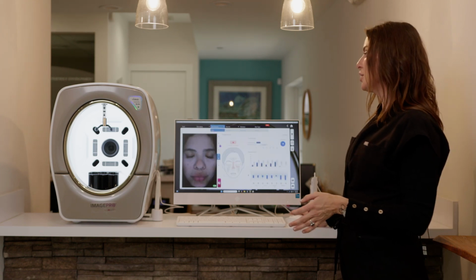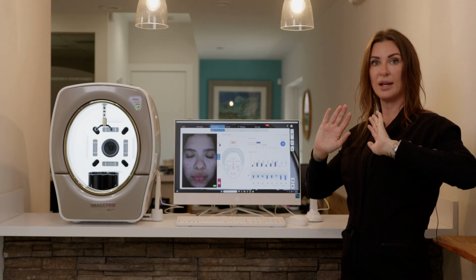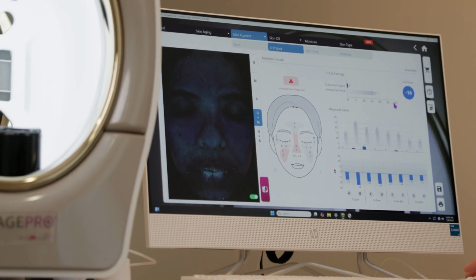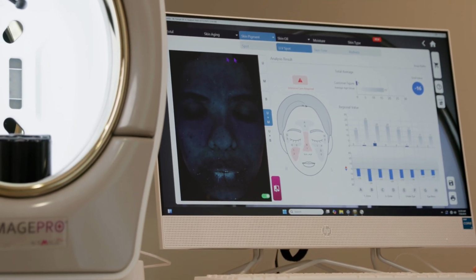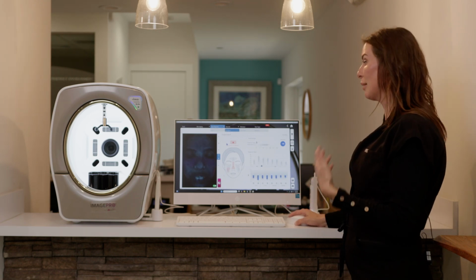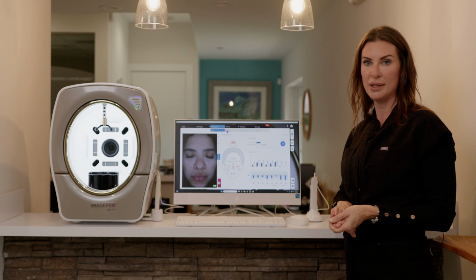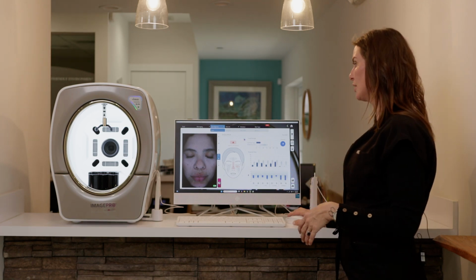Skin pigment. So this is actually seeing epidermal pigment. So this is what we see with the naked eye. And then UV is seeing what lies below the surface of the skin. She's 16 better off than those of her average age group, which is amazing. A lot of times you'll see a lot of very dark dots here, kind of like a warning sign. If we don't do something about this, this is what it's going to look like, but she's amazing. So we don't have that example in this situation. If these were issues, what are we going to do? Mostly light-based treatments, right? So IPL, laser are going to be great for your spots and UV spots.